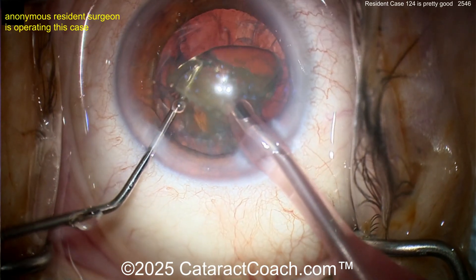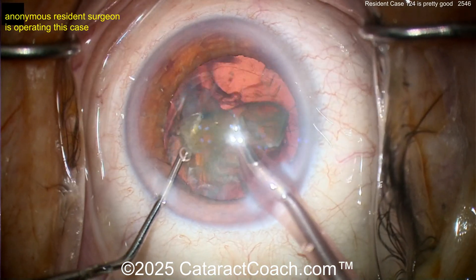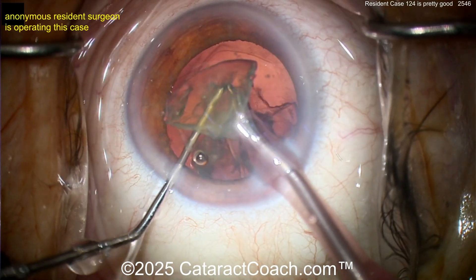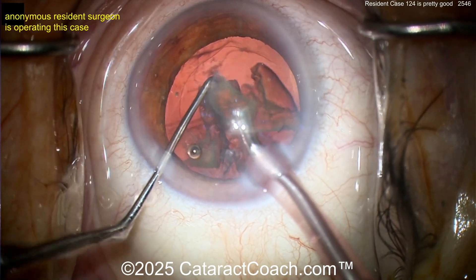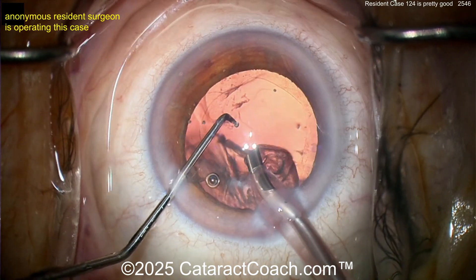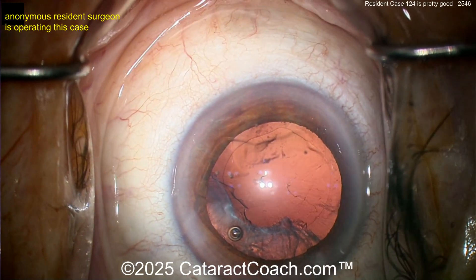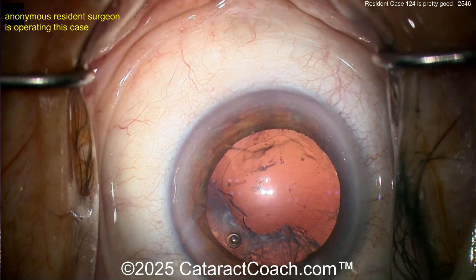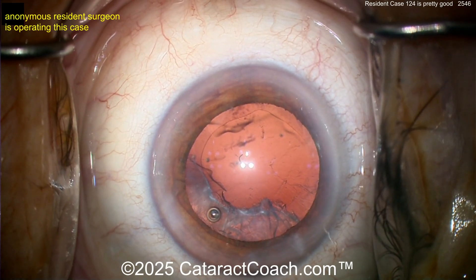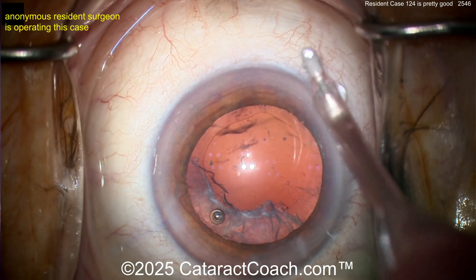Try to get the eye back in primary. Put the right hand down a little bit — notice how it's drifting to the top of the screen, which is the patient's nasal side because the surgeon is sitting temporal. That's better. But look at that AC bounce — there's a bit of fluidic instability. I'd increase infusion or decrease your outflow. Also remember the safe chopper position. Some surgeons like to remove the chopper as the last piece comes out, because if the paracentesis is leaking around the chopper, removing it lets the wound close and improves chamber stability.